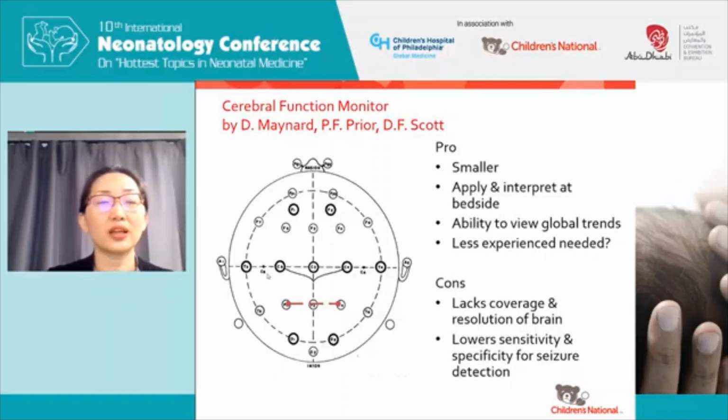And also the most likely insult after some type of major cardiac surgery would be a hypotensive insult. With a hypotensive insult, you would get a watershed or parasagittal pattern of injury, which by placing the electrodes in the parietal area, one would be likely to capture.